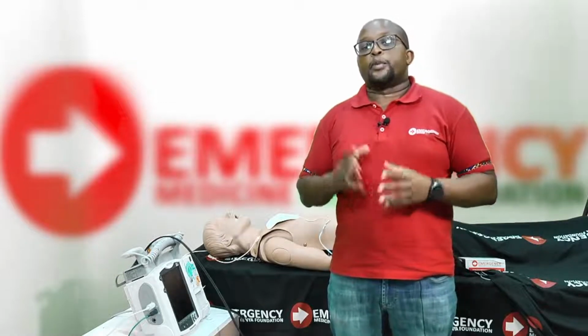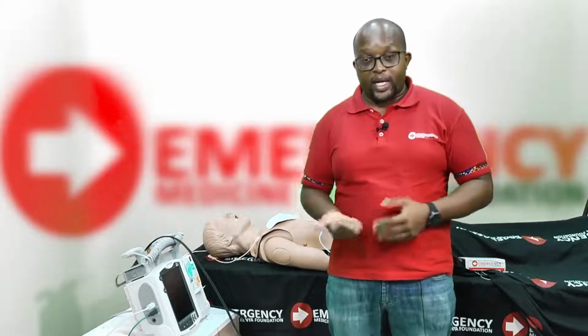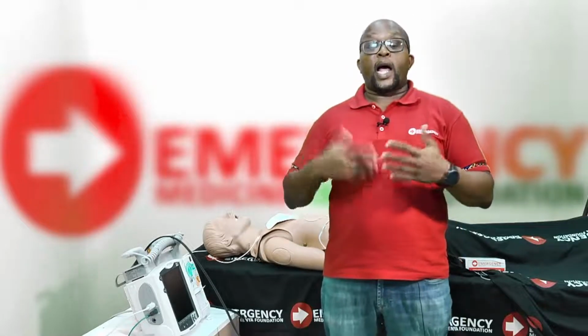For this section of the video, we're going to discuss pacing. Now, pacing is a bit different from the defibrillation and the cardioversion that we discussed earlier. Essentially, what pacing does is augment the patient's heart rate to a rhythm that then allows perfusion through the patient's body. So the indication for pacing is a bradycardia, normally a heart rate of less than 50, in a patient who has clinical features of shock, things like altered mental status, chest pain, shortness of breath, and hypotension.